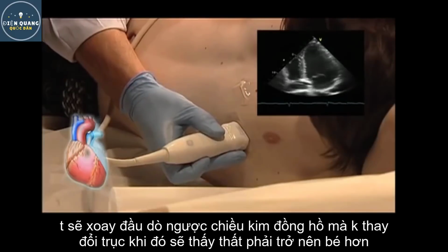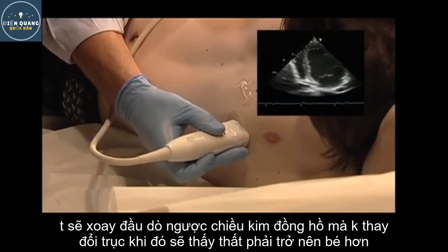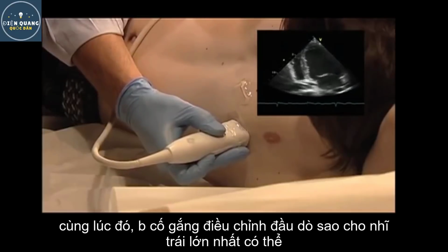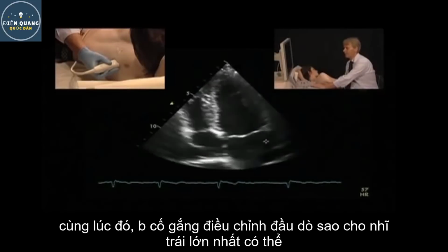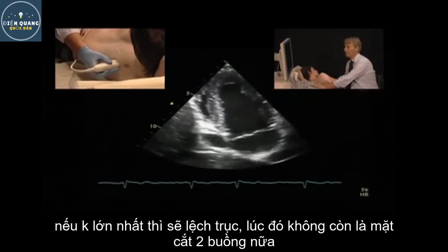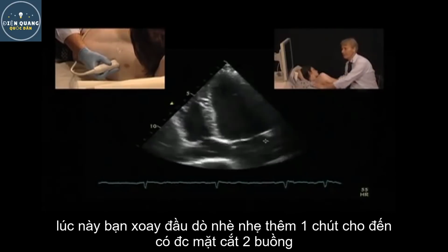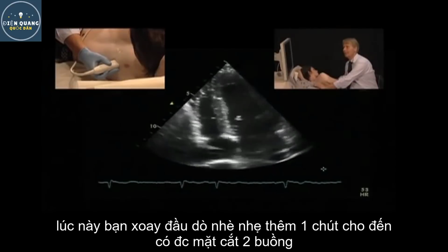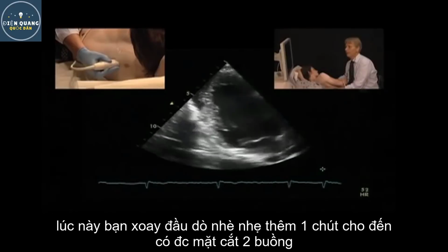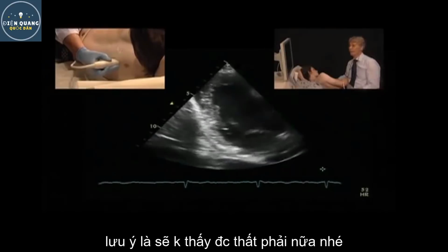slowly counterclockwise, and you will see that the right ventricle gets smaller and smaller, and at the same time you will have to try to assure that the size of the left atrium remains as large as possible. If you lose the size, you will also tilt out of your axis and you will not get a decent two-chamber view. So this is basically just to give you an aid that you're still on track. So you rotate more and more until you finally arrive at the two-chamber view where you do not see right ventricular structures.